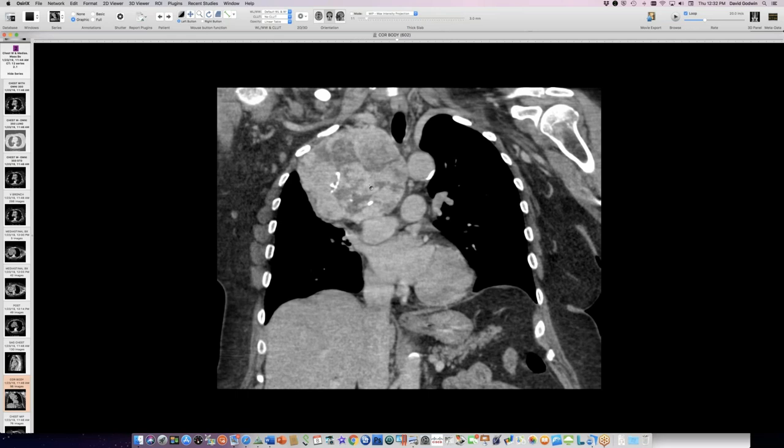Okay. Have you ever seen calcifications in a paraganglioma? I'm trying to think. Of course, I haven't seen too many, but I don't recall seeing dystrophic calcifications in a paraganglioma. That's a reasonable point. I have not seen that many paragangliomas, but the case I showed 2 weeks ago, I think, did not have calcifications. I'll check it.